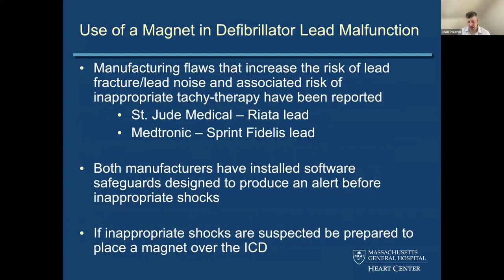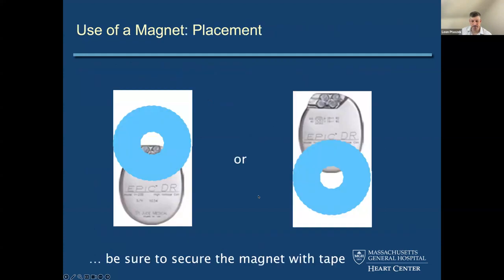And again, know that there are several examples. And again, every manufacturer's had an issue over the years. But just be aware that there's certain leads out there that have been associated with a higher frequency of problems. These are long since off the market, but you may encounter a patient with a legacy device in which you need to be ready for this kind of thing. Always be ready to reach out to your local representative for any manufacturer in which you have concern about lead malfunction.